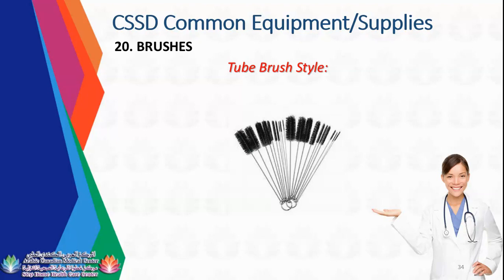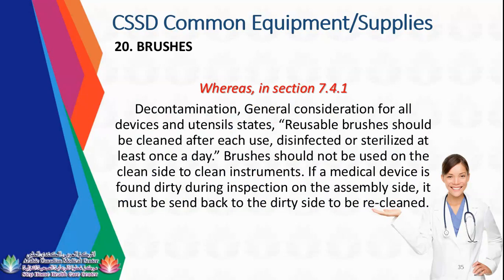So decontamination, general considerations for all devices and utensils: reusable brushes should be cleaned after each use, disinfected or sterilized at least once a day. So once a day, once you've done your work or once you've done your shift, or every shift if you have two shifts in your facility, then every shift it will be disinfected.